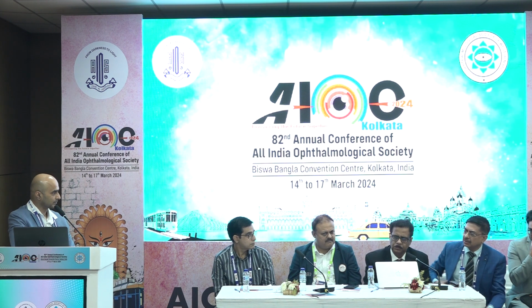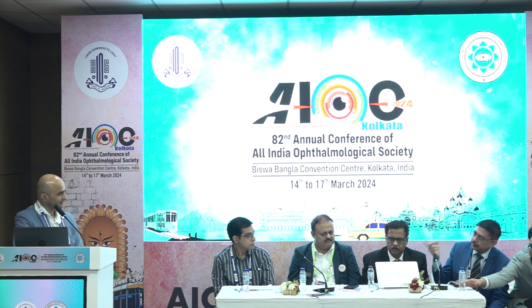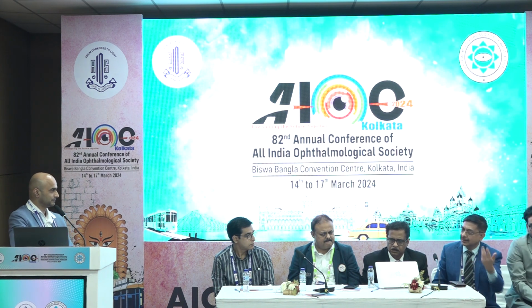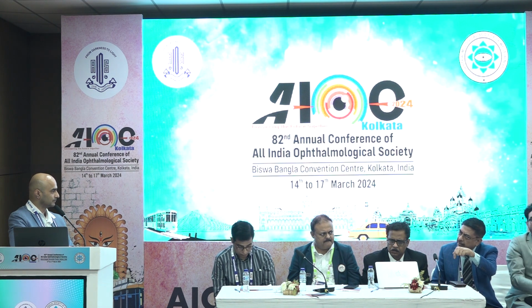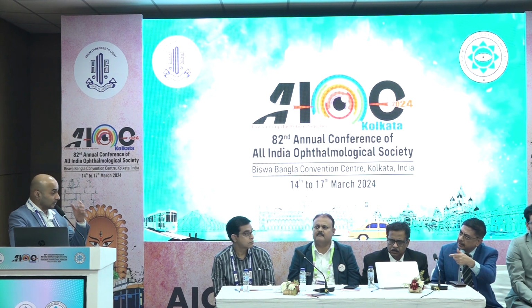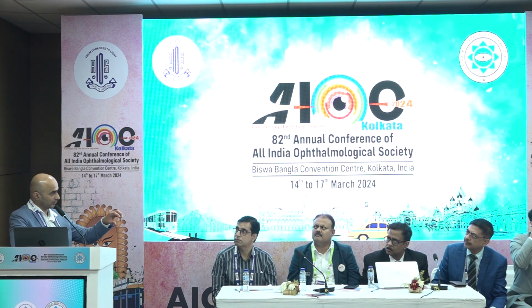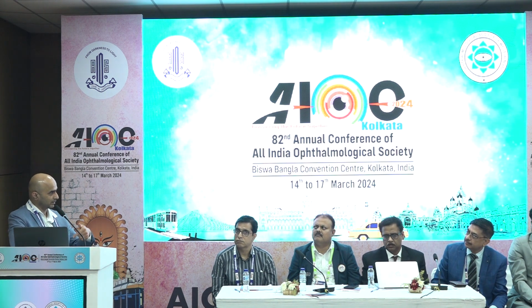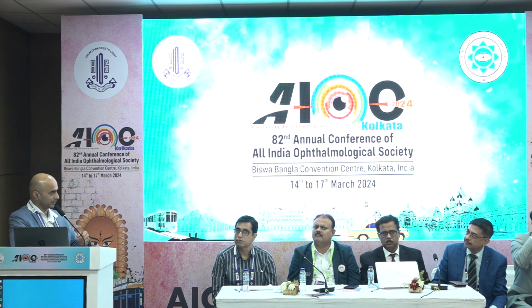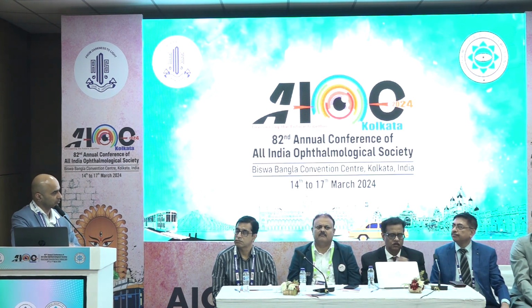Did he have a pre-existing nasal break through which you entered, or did you make a retinotomy? No, I first made a retinectomy nasally to remove the silicone oil from that area. Peripheral? Peripheral. And then there was a subretinal band on the temporal side, which I was anyway going to pull out. And through the same opening, I removed the silicone oil.